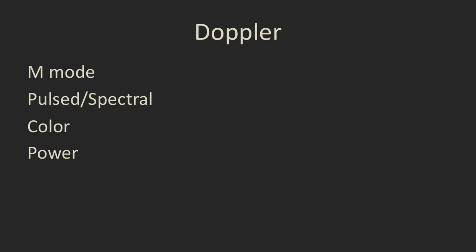Doppler ultrasound gives us the ability to detect, display and measure movement, usually flow. I'm not going to talk about the physics of it. There are four different types of Doppler ultrasound I'm going to talk about in sequence: M mode, pulsed or spectral Doppler, color Doppler, and then power Doppler.